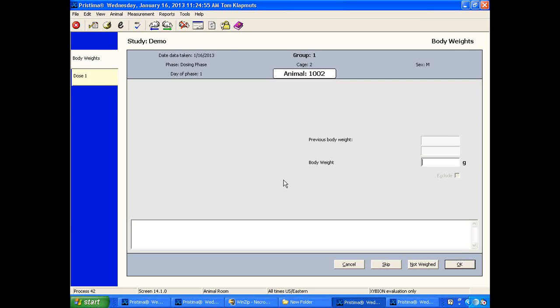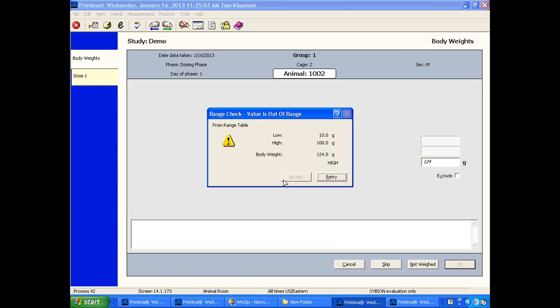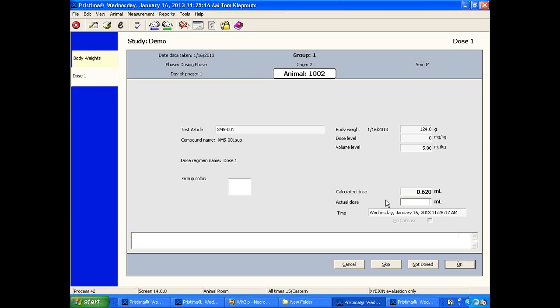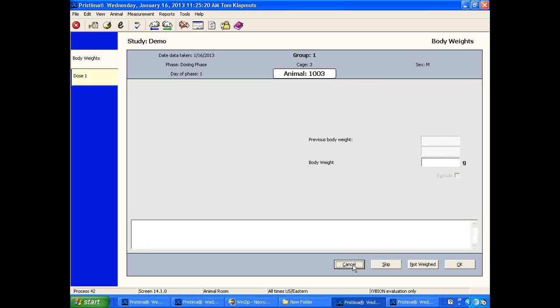And we'll go on to the next animal. Again, you can have the system set up to sequentially go through animals. You can have it set up to scan microchips. You can have it on a confirm mode or a search mode. I just wanted to dose 2 animals to be able to show you the time to bleed module. Okay, dose this one.